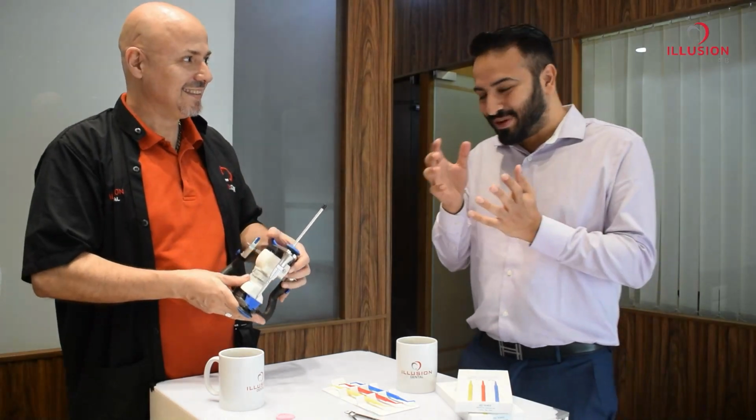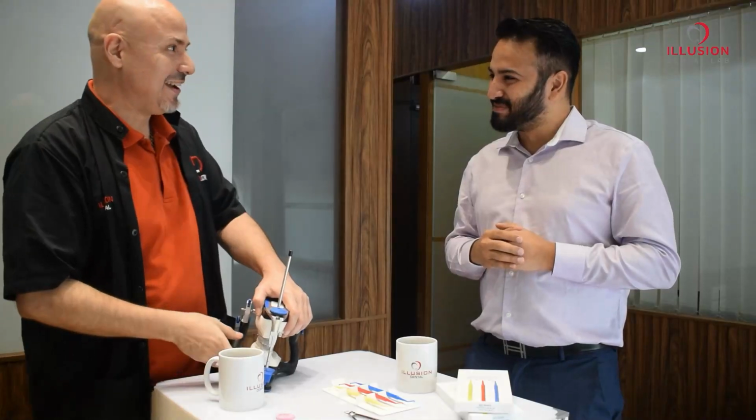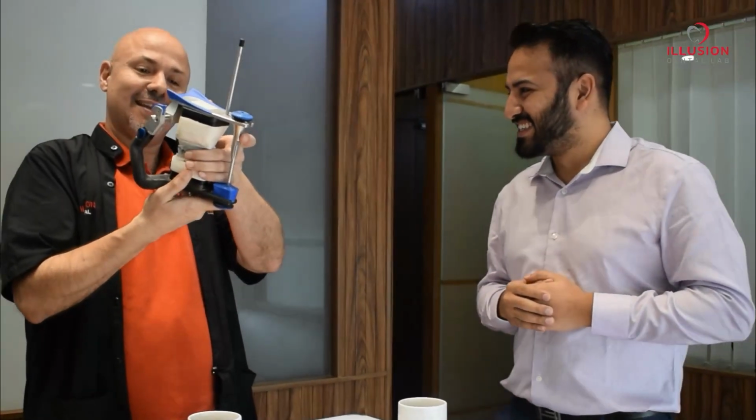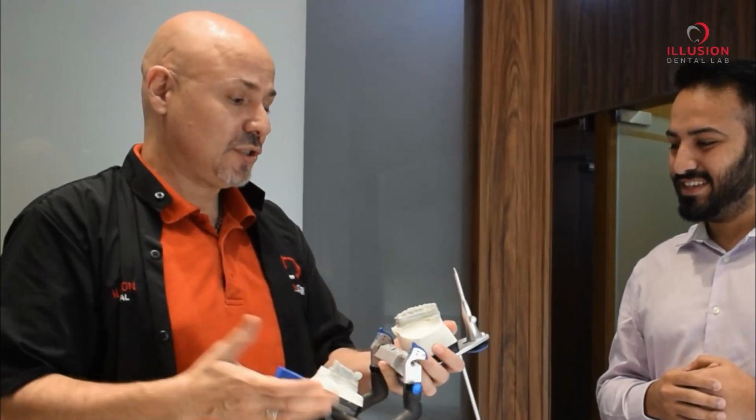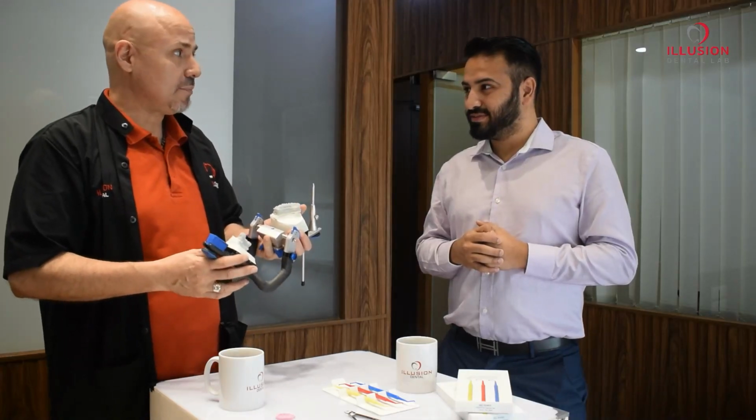We see it on the models, we can turn the model, look from the back and say, oh, here there is no clearance, doctor, you missed it. But the patient has to suffer, they have to be called in again, or the prosthesis breaks, some chipping will happen.